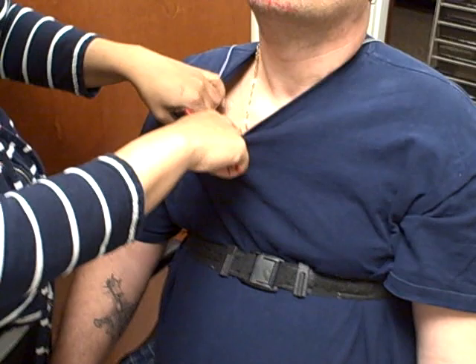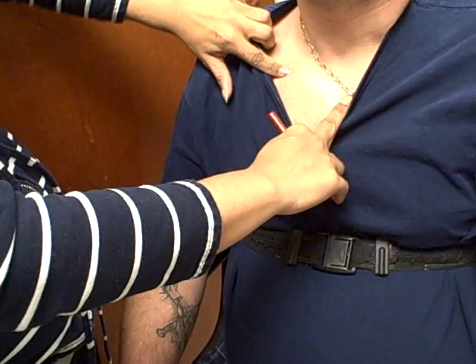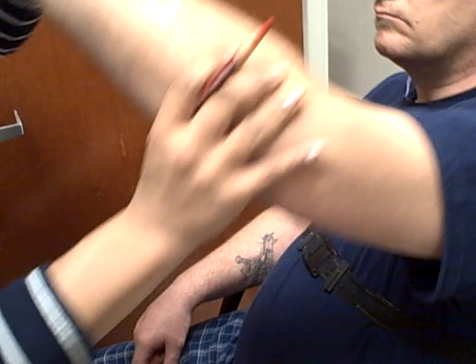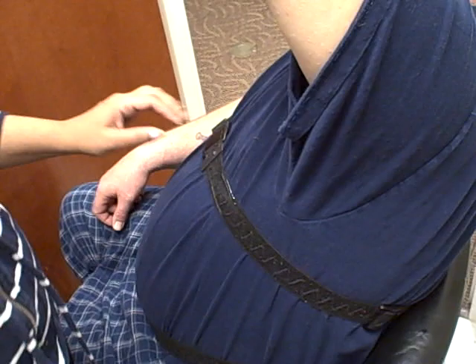For the chest EKG, you're going to come down three intercostal spaces on the left mid-clavicular line and put a marking there — that's EKG 2. The other EKG marking is mid-axillary, and you're going to come down to the fifth intercostal space, so the EKG electrode would be just about here. That's where we'll put the other marking.